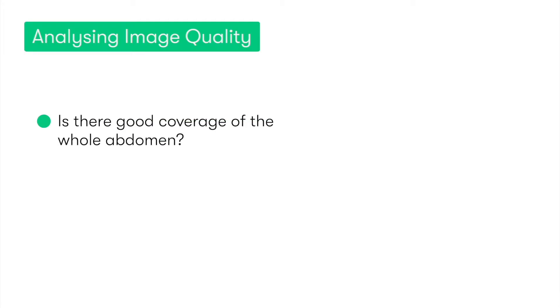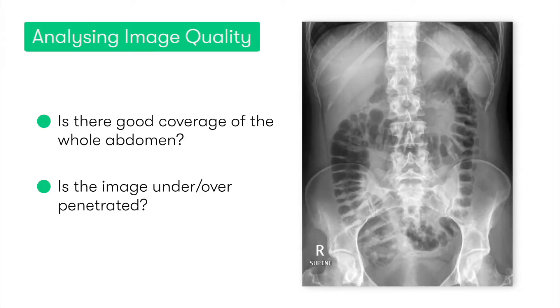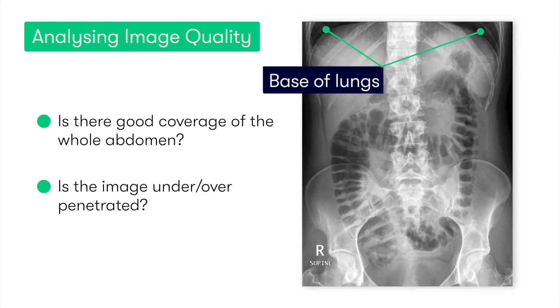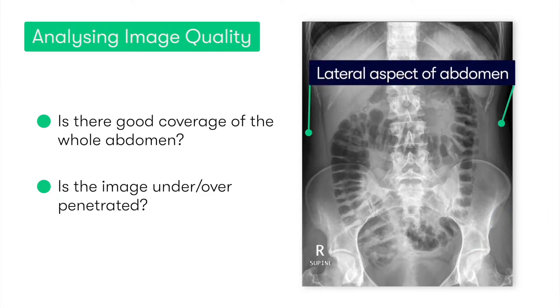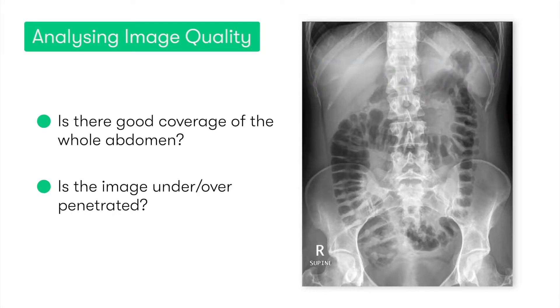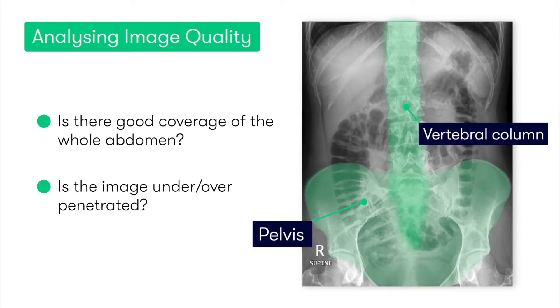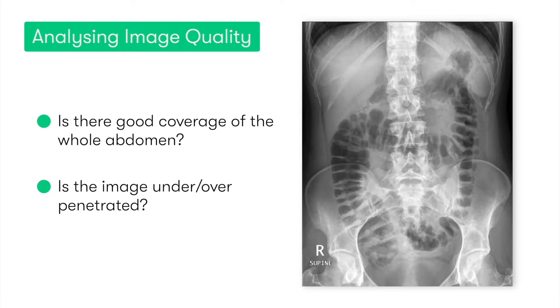When analyzing the image to ensure it's good enough quality, the key things we want to look for are: firstly, if the whole abdomen is covered in the image, and also if the image is correctly penetrated. In an AP view, coverage should extend from the base of the lung superiorly to the proximal femur inferiorly, incorporating the lateral aspects of the abdomen. Adequate penetration is indicated by the visibility of the vertebral column and pelvis posterior to the abdominal contents — if these bony structures aren't visible, the image may be underpenetrated.